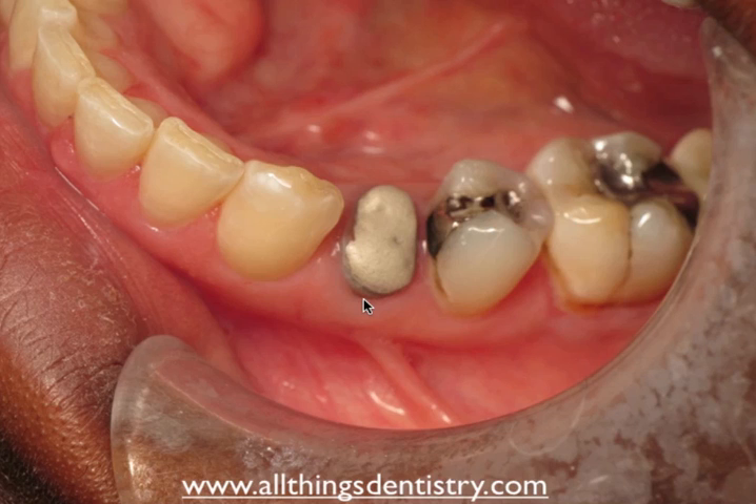During the crown lengthening procedure, you look and think it looks good, but then you measure and think, 'eh, the patient has been here long enough.' All those thoughts pushing you to skip that extra three minutes of ostectomy lead you to just suture and call it done. Take that extra time — a little pain up front in terms of time will save you tons of time down the road, especially when making a final impression, and will improve the longevity of the restoration. So based on that, we're going to go 3 millimeters apical from the predicted finish line and remove approximately 1 millimeter of gingival tissue around the entire circumference of the tooth.